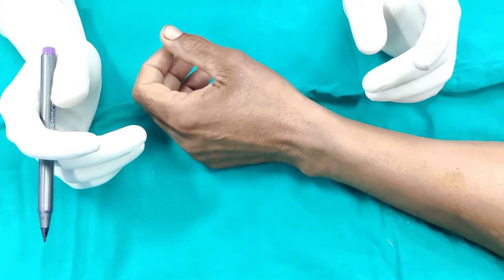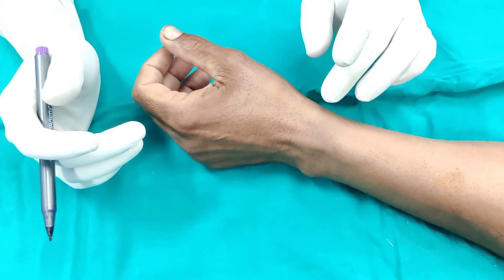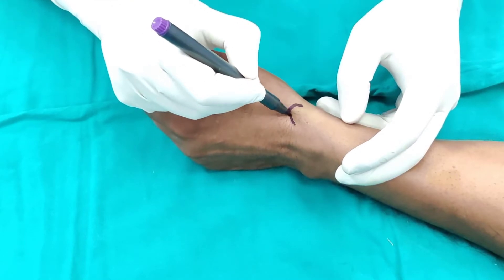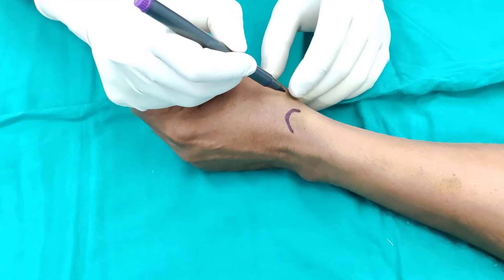Our patient is ready. We have cleaned this area with plenty of alcohol solution. The landmark is the radial styloid — I'm just drawing up the radial styloid for you. It's somewhere here. The base of the thumb is somewhere there.